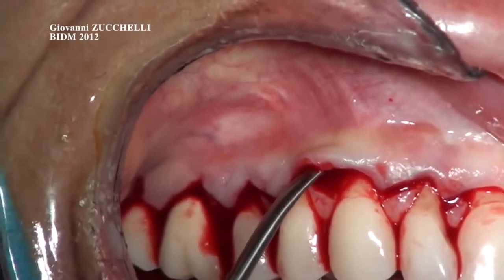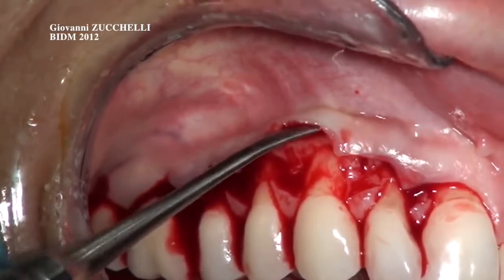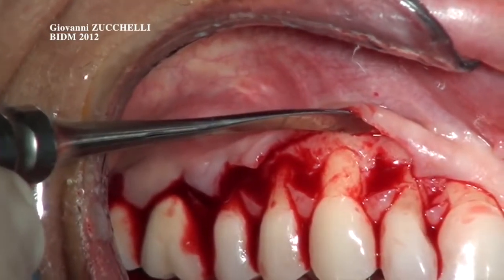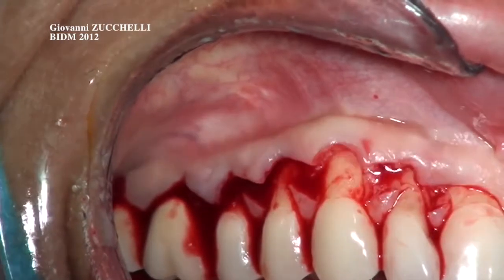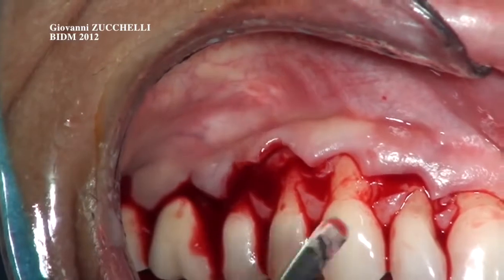The same now is done at the level of the canine. I see the bone crest, and once the bone crest is reached, I elevate it with 2 or 3 millimeters of bone exposure. Now the premolar, 3 millimeters of bone exposure.